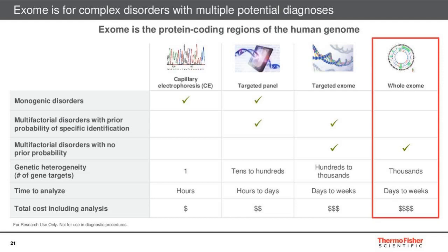And exome sequencing is often used to research diagnostic odysseys where prior chromosomal arrays, single gene, or multi-gene panels have been unsuccessful at identifying a variant related to the phenotype. Since the goal of whole exome sequencing is to identify genetic variants that alter protein sequences, this is a test that can identify variants responsible for Mendelian and common polygenic diseases at a lower cost than whole genome sequencing, but of course is still a bit more expensive than those smaller panels.